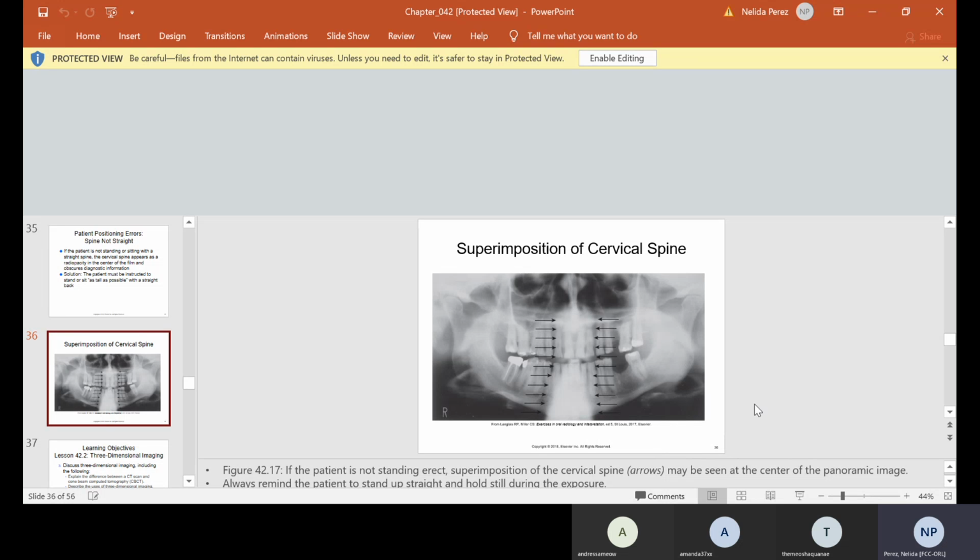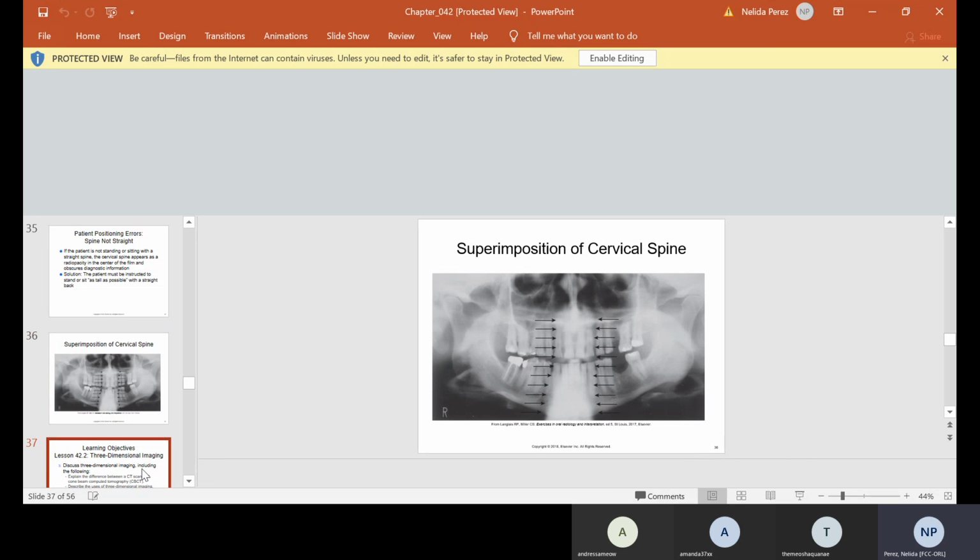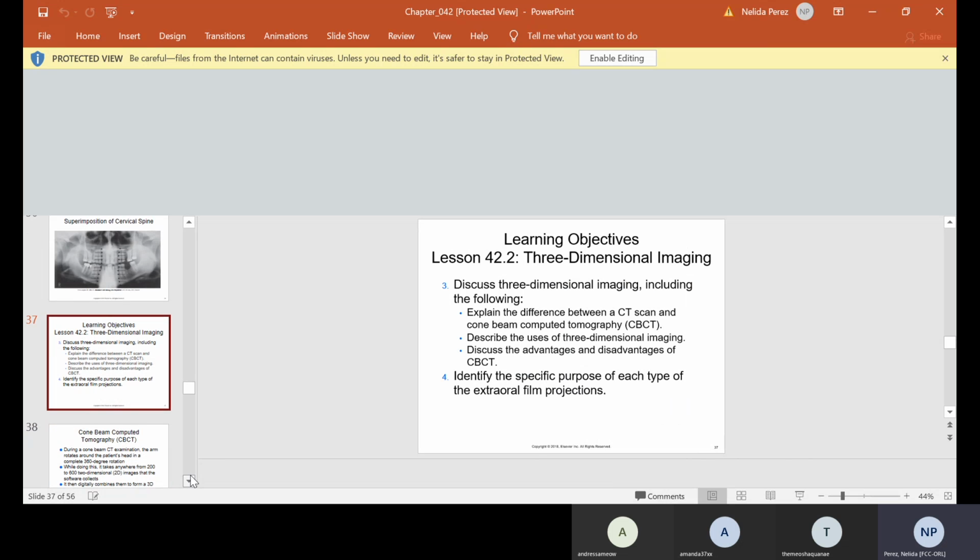But I do want to point out that over here, this is a root canal on the right side, okay? Notice here, there's some missing teeth. So when we chart, of course, we wouldn't be using this x-ray, but when we do chart, we do need to see on the panel what's missing, and we chart it, okay? Any questions?